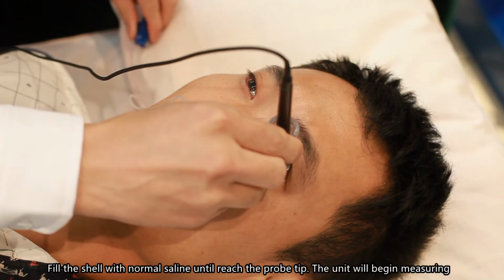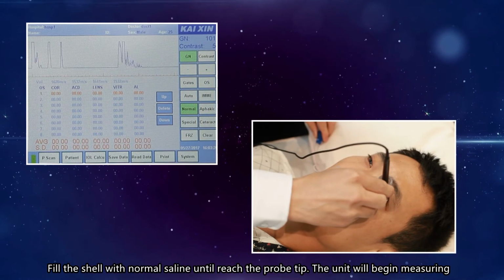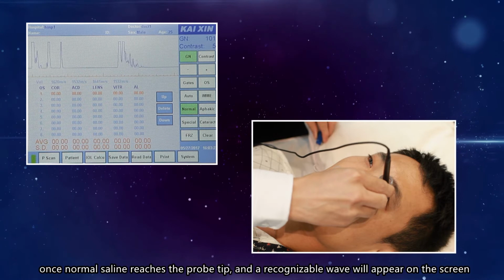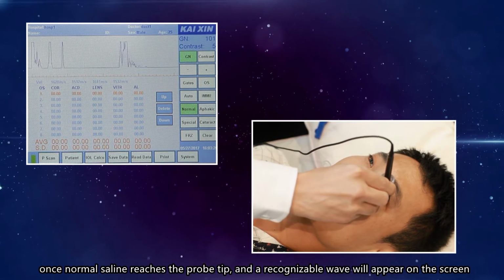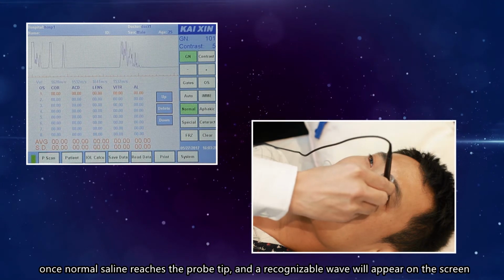Fill the shell with normal saline until you reach the probe tip. The unit will begin measuring once normal saline reaches the probe tip, and a recognizable wave will appear on the screen.